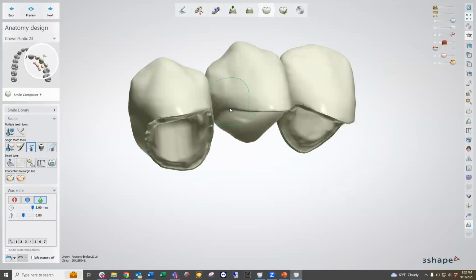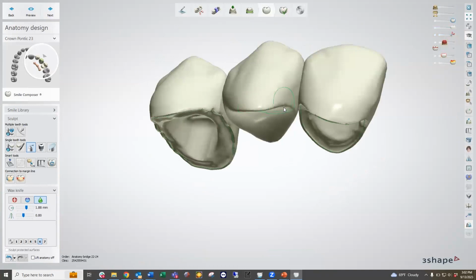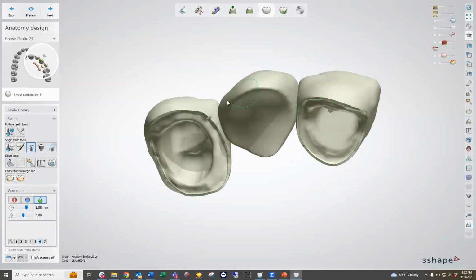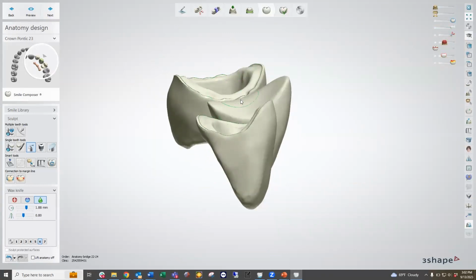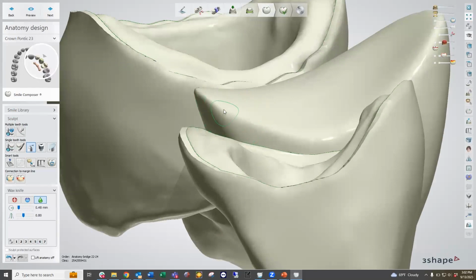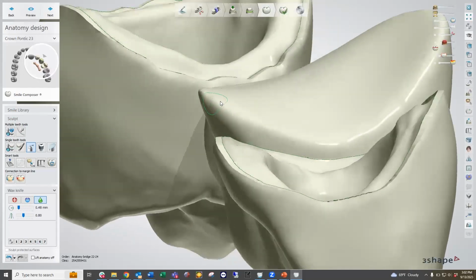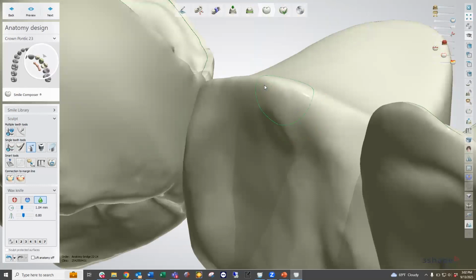I'm going to go ahead and smooth up that finite edge, because sometimes it does create this knife edge, which isn't always desirable and doesn't always feel good. So I always smooth that up relatively quick. And then I take a look at the design and make sure that there's no ridge lap. I don't like any sort of ridge lap on my units. So I'm going to smooth up this ridge on the back, on the lingual side, to ensure that there's not going to be any sort of ridge lap on the pontic area. Okay.